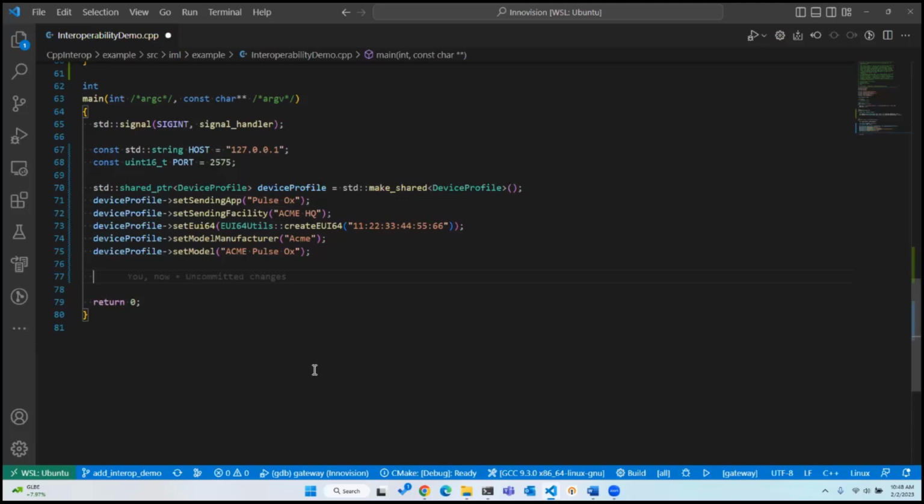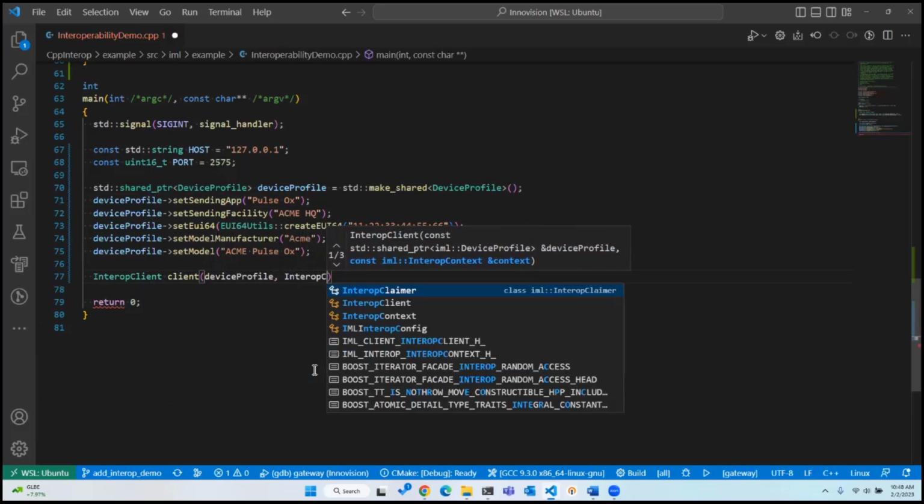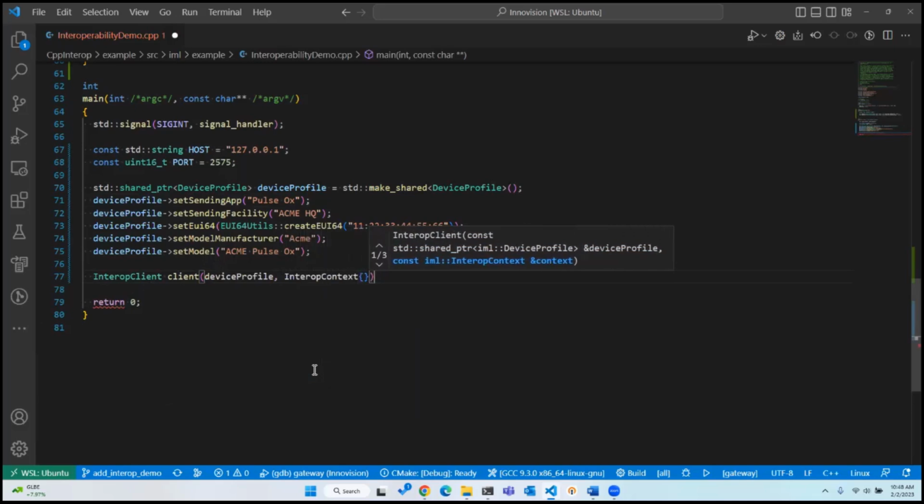So the next thing that we need to do is to define how we're going to send data to the super EMR. So in order to do that, I'm going to use the Interoperability Library's Interop client. This class is useful because it simplifies managing all the details needed for your device to be considered interoperable. So I'm going to give it our device profile here. And it also takes an interop context. So I'll just create an empty one right here.